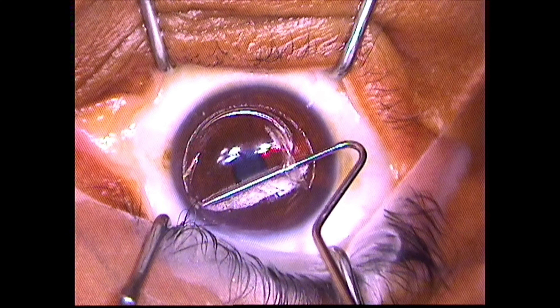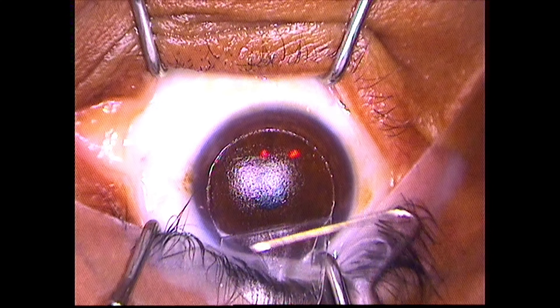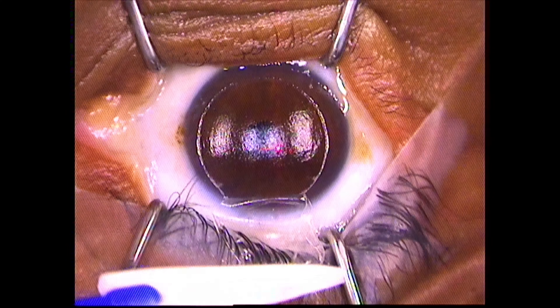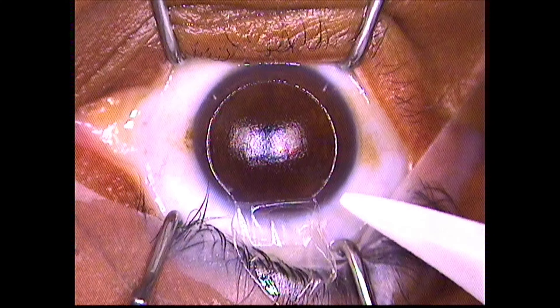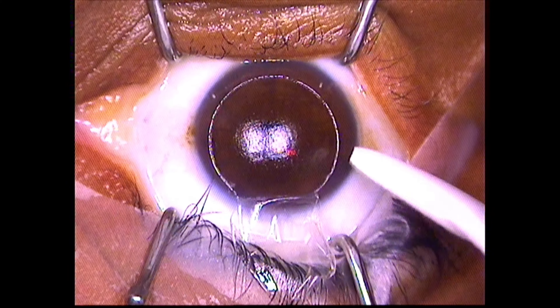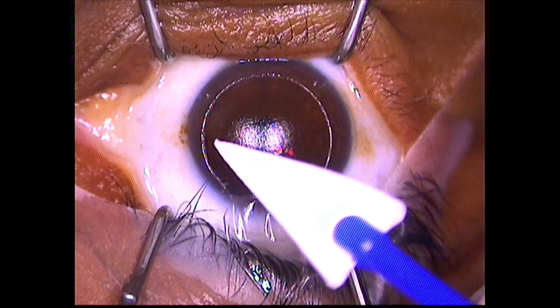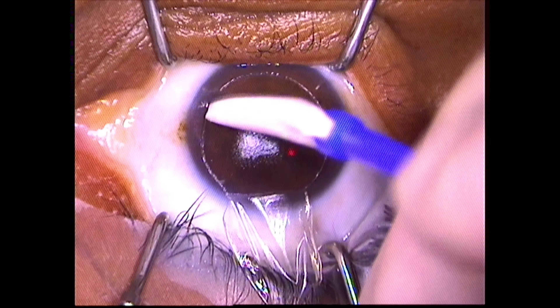The spatula is then used to lift the flap. The treatment laser is then applied in the same way as for a first-time LASIK. This is typically a shorter treatment because enhancements are usually smaller prescriptions. Epithelium is brushed back from the edges of the flap with a surgical sponge.